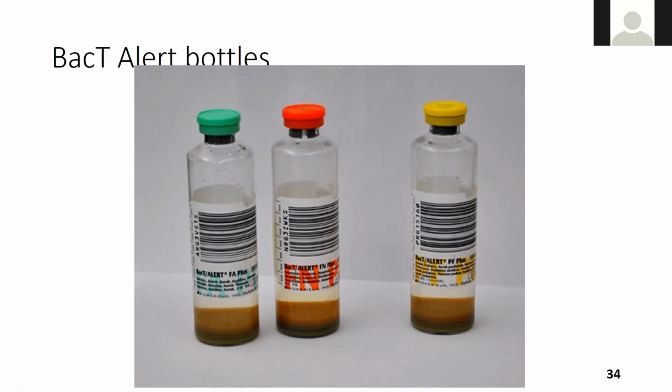So think about that. Get one yellow top from a sterile draw, it should have 10 mils in it, maybe 8 mils, maybe 6. I'm getting them like this. Yeah, I put a splash of blood in there for your blood culture. Well, then that forces you to use the pediatric bottle, and you shouldn't have to be forced to do that.